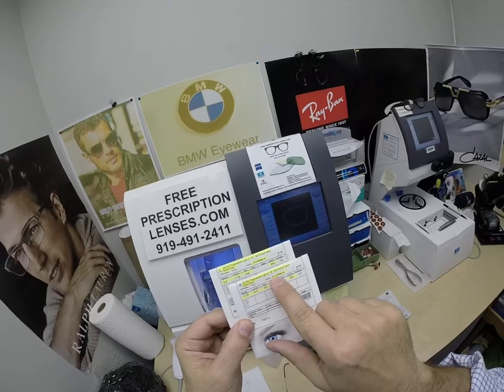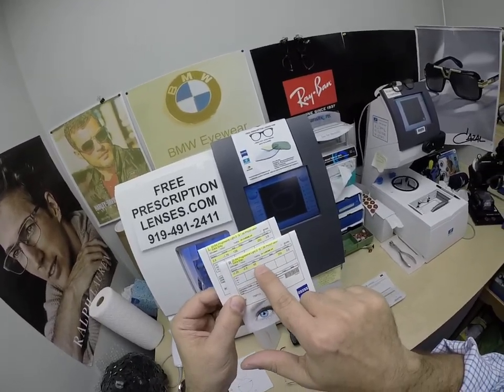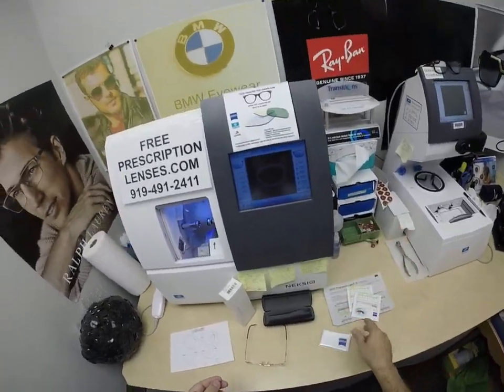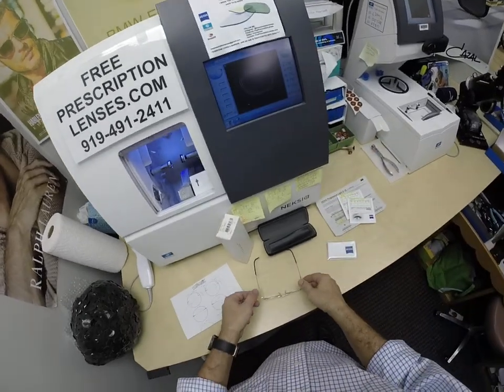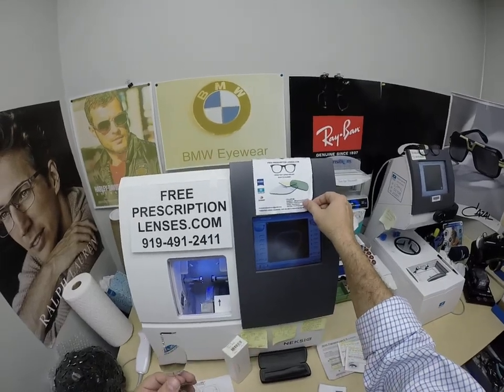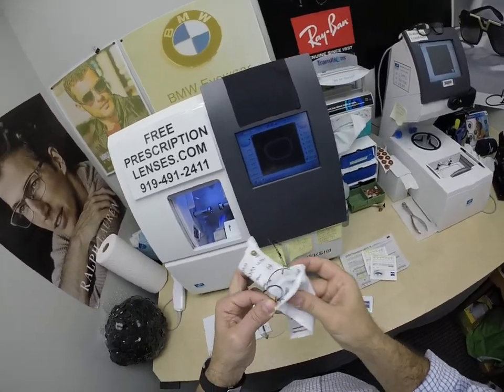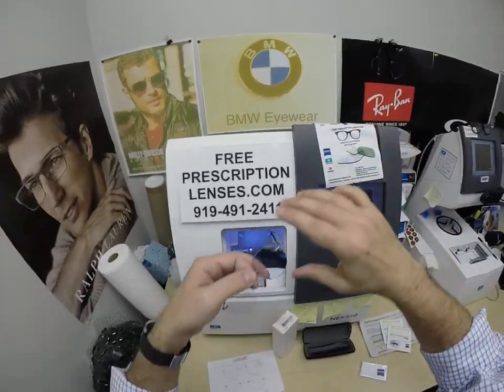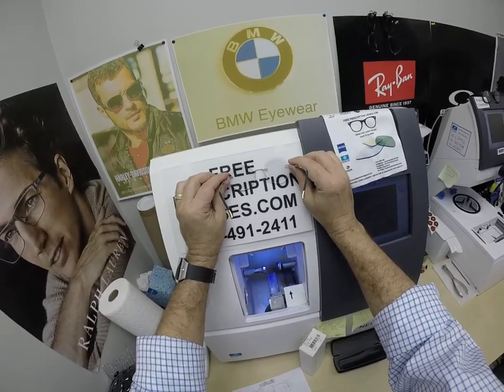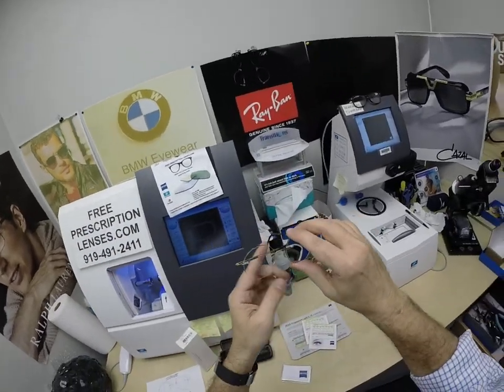The Photofusion Extra Gray with DuraVision Chrome anti-glare treatment — prescription highlighted for the right eye, add power, same for the left. You're going to get the Zeiss cleaning cloth, one of my premium microfiber cloths, as well as instructions on how to care for the frame, lenses, case, and all three cleaning cloths — those will last you for years. This is what the Zeiss Photofusion Extra Gray looks like indoors: very, very clear, maybe 3 to 5% residual hue.